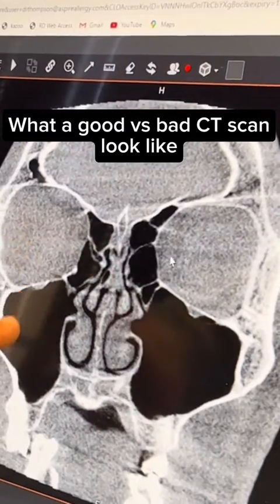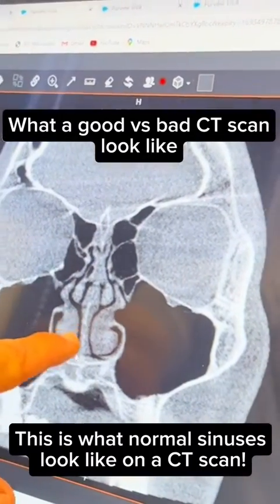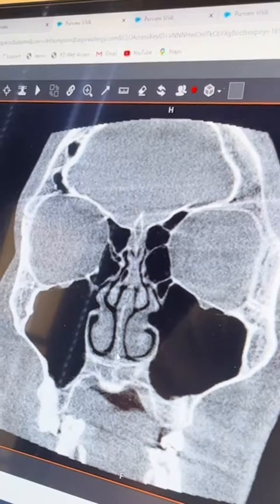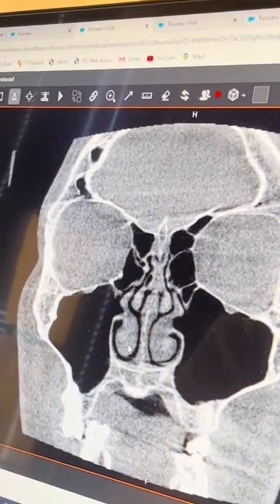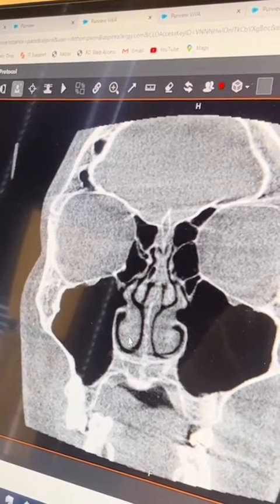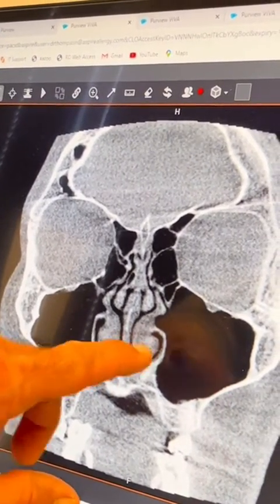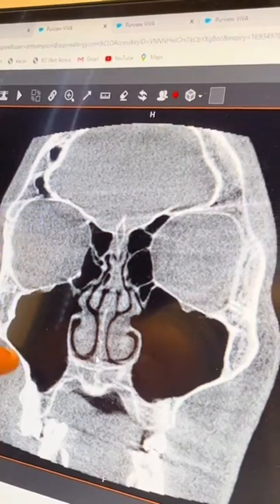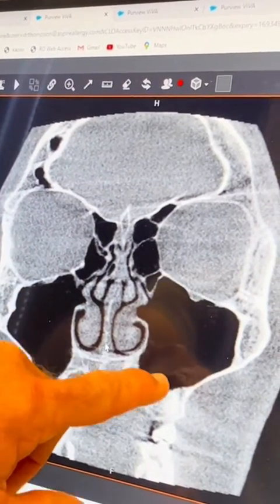That's the right eye. The septum is right here. The septum just divides the nose into two cavities, and then we've got these big gray blobs which are the turbinates — those often cause reduction of airflow. In his case, he has big turbinates, but the rest of his scan looks pretty good.